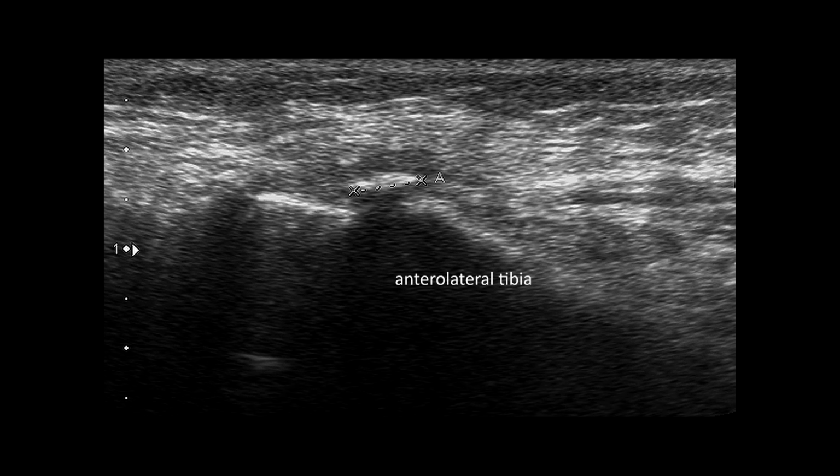This longitudinal view demonstrates an avulsion injury at the distal insertion of the anterolateral ligament. A small osseous fragment is visible at the lateral tibial margin, consistent with a Segond fracture. This type of avulsion results from traction on the distal anterolateral ligament during internal rotation injury mechanisms.